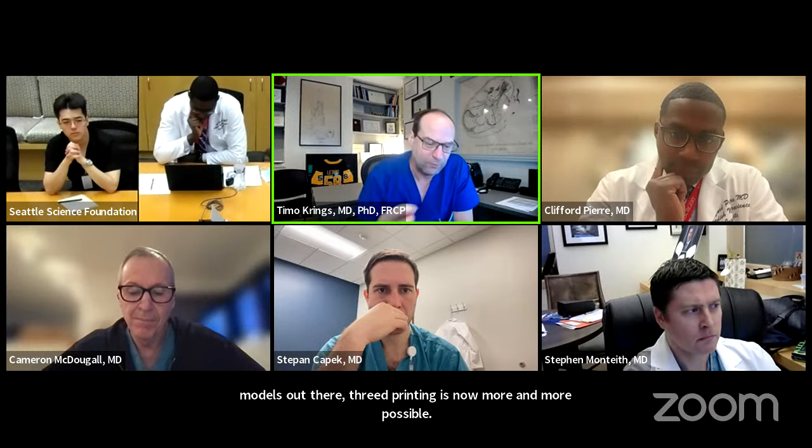So I have three classical concentrations: 50-50, the nearly undiluted or 100% glue, or like the 30% for the really slow flow one. And I believe there are now some models out there. 3D printing is now more and more possible. With variations of flows and variations of arteriovenous transition, we can try to teach physicians on a model using glue as an embolic agent, but it is still very difficult to teach this. I fully agree.